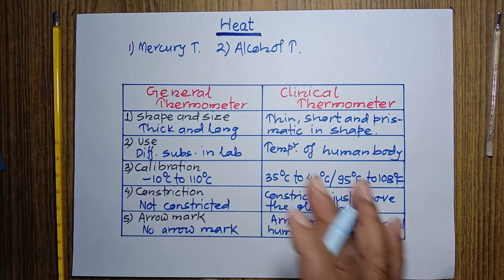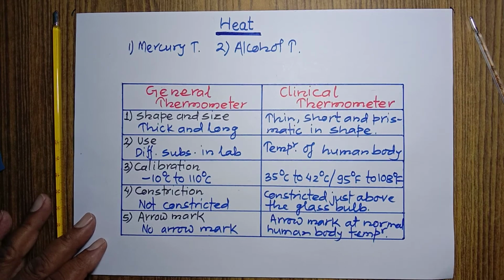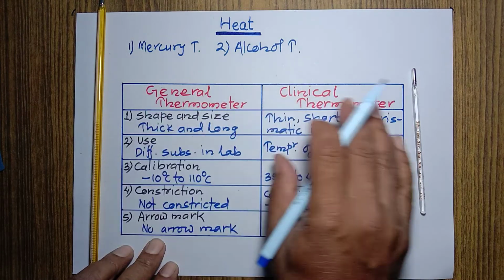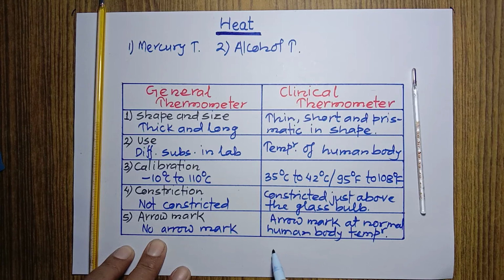Okay, these are 5 major differences between the general thermometer and the clinical thermometer, and our target was to differentiate between them with different points. It's completed. That's why this much for today.